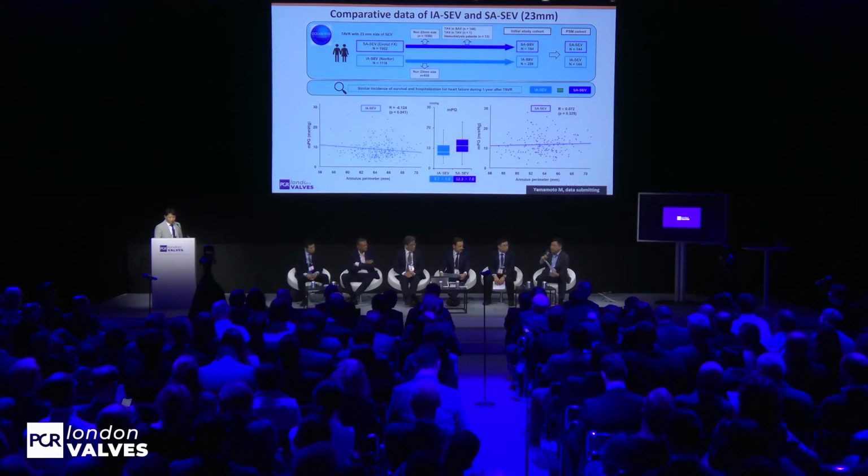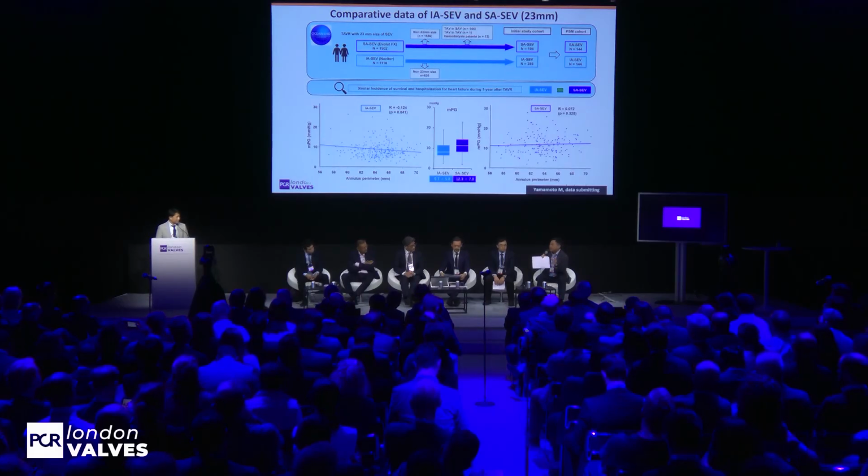Thank you so much, Masa. One question, sorry. I think small annuli are not all the same. Some small annuli are circular, some are very elliptical. Your case is very elliptical. So is the difference dependent on the circularity in your data?